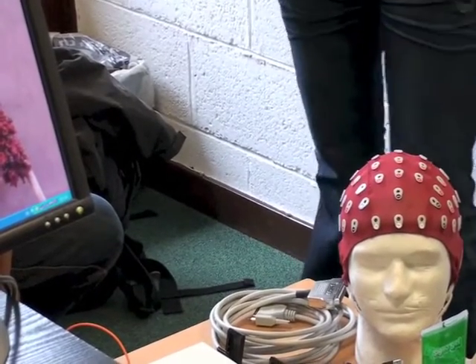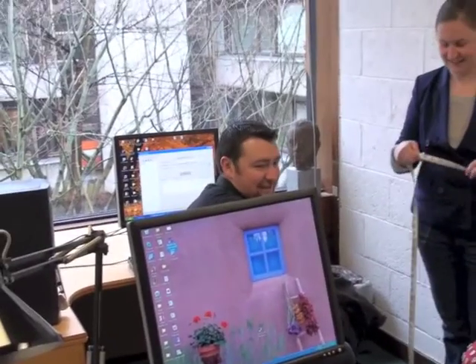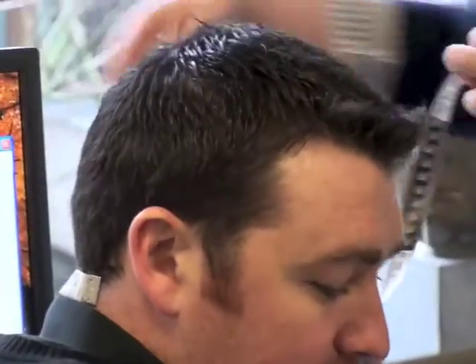Okay, so it needs to be quiet. Do you mind if I measure your head? No, it's fine. She's asking me now on camera, not before. Sorry. So you just measure around like this, and here. Do you mind me saying how big your head is?